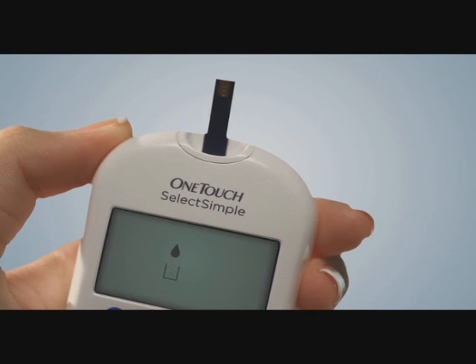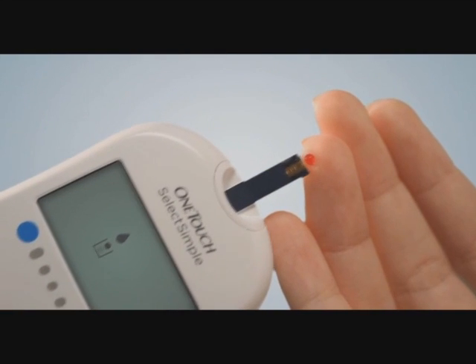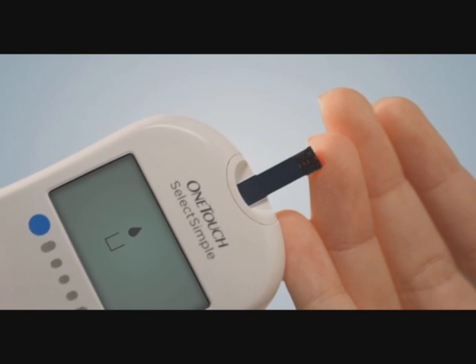No more coding required. Keeping your finger extended and steady, move the meter and test strip to the blood drop, gently touching the test strip channel to the blood drop.